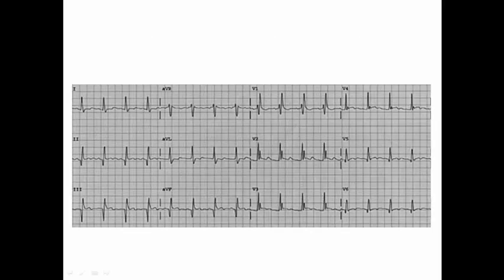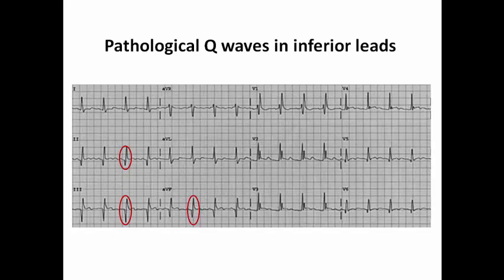In this ECG also, we can see pathological Q-waves in inferior leads fulfilling the criteria, as they are exceeding 30 ms. The ST segment seems to be isoelectric, so it may indicate an old inferior MI. But of course I should check the clinical context and assess the patient in order to decide whether it is acute ongoing myocardial infarction or old infarction.